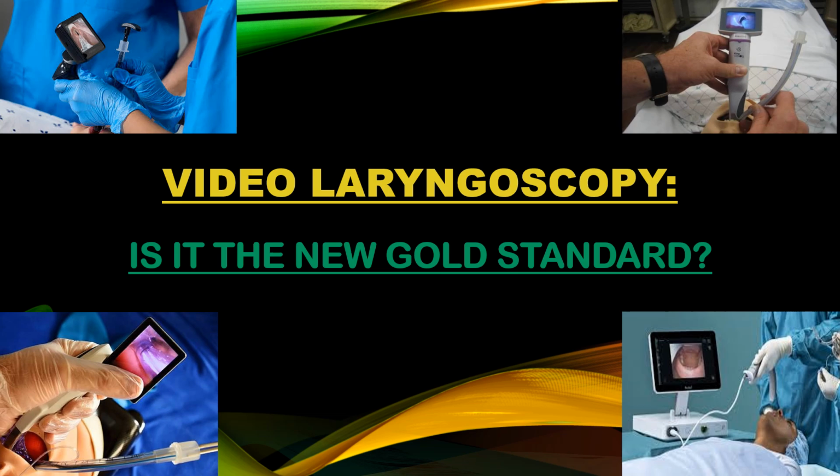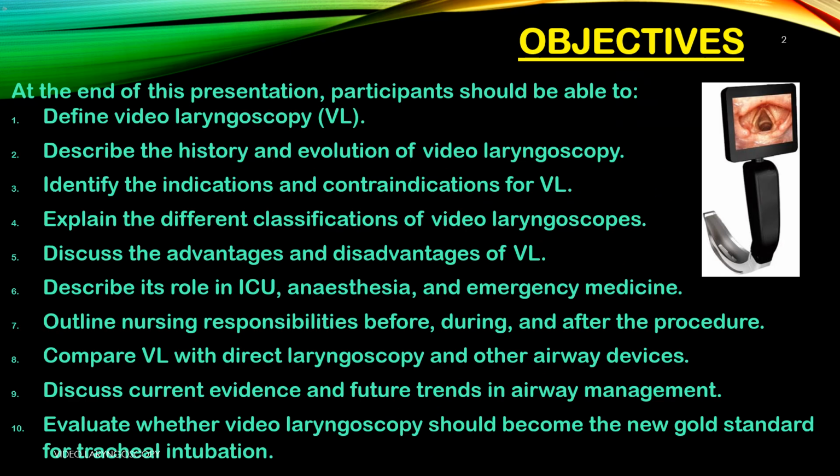Is direct laryngoscopy still enough? Or has video earned its place as the new default? The technology is here. The data is growing. The debate is real.